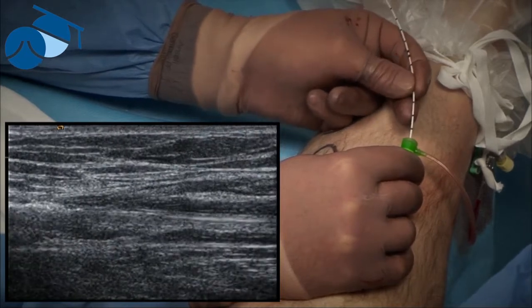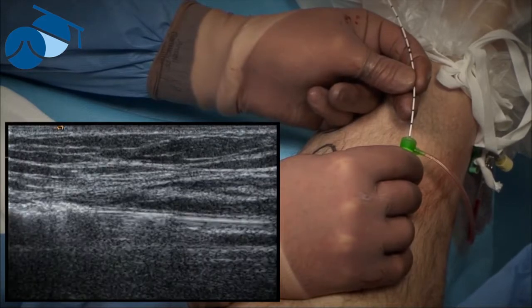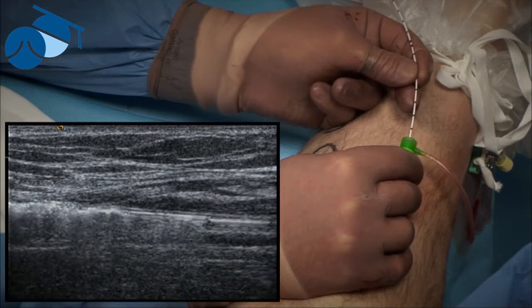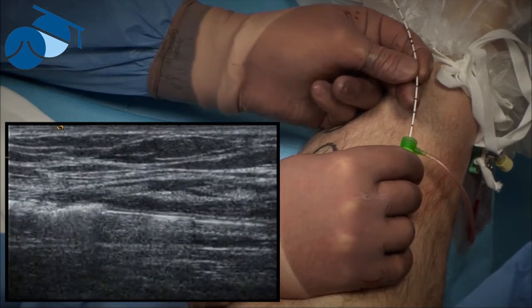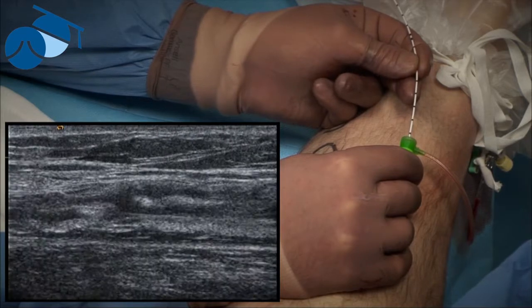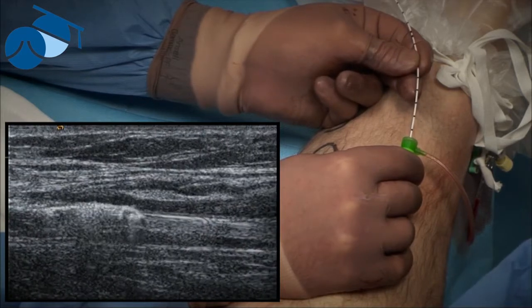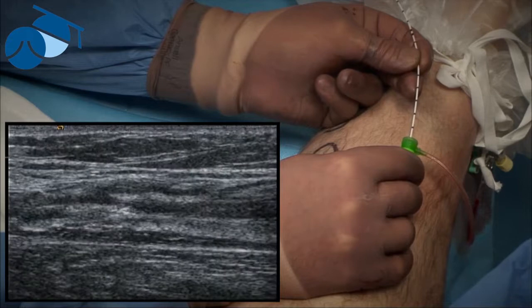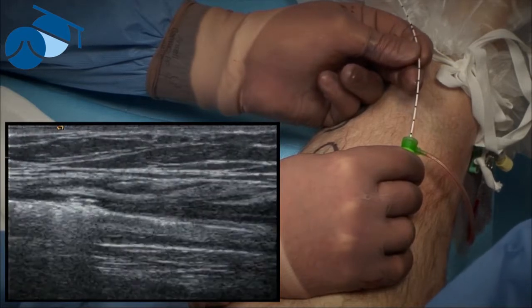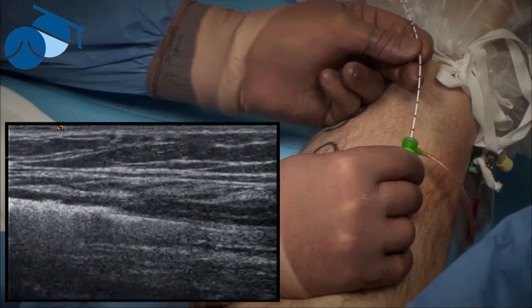So again we do it, usually by the 3rd centimetre there's no catching anymore. So just checking there's no catching there, so we can now just continue every centimetre at 8 seconds. And there's the break at 8 seconds. And this is a continuous pullback, trying to get it as smooth as possible, not just giving aliquots of energy at every centimetre.